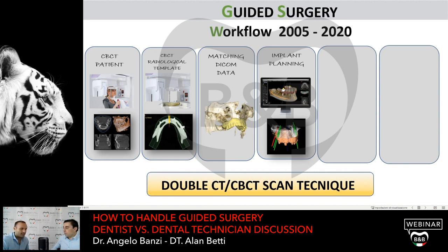And remember that the implant changes position depending on whether I'm going to finish the case with a cemented prosthesis, or a screw prosthesis, or with straight abutment, angulated abutment, multi-unit abutment, or ball abutment.